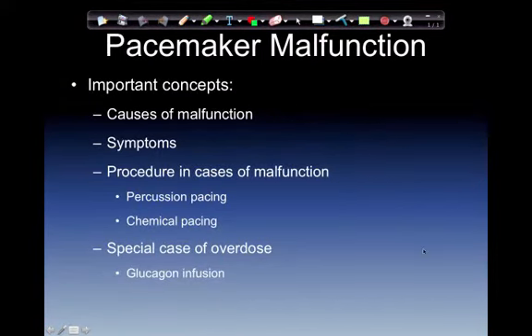Pacemaker malfunction. Pacemakers malfunction for a pretty minimal list of reasons. It failed to discharge for whatever reason, it failed to capture for whatever reason, and it failed to sense for whatever reason. And you can also get some oversensing problems, where it failed because it's sensing everything. Symptoms of pacemaker malfunction are going to be things like syncope, where the patient just loses cardiac output, palpitations in their chest, and bradycardia.